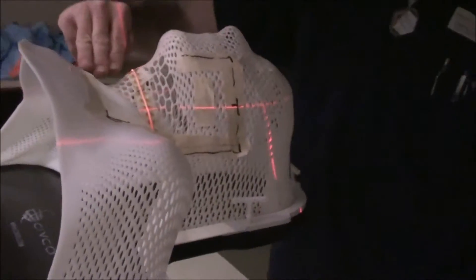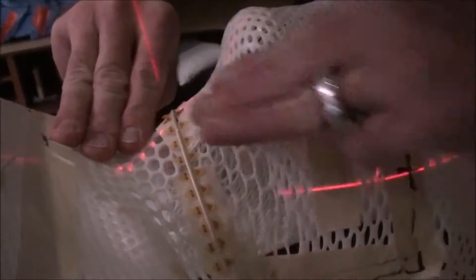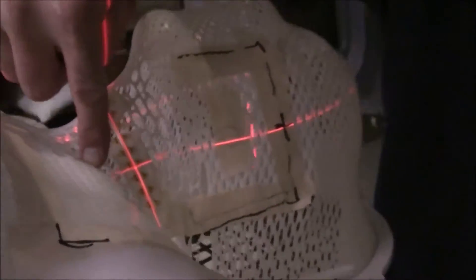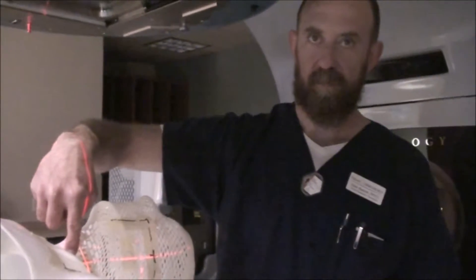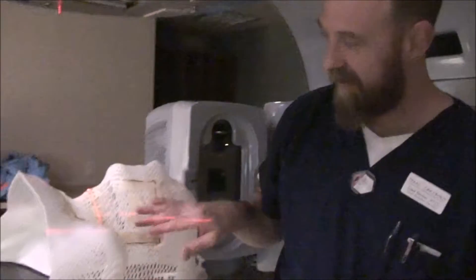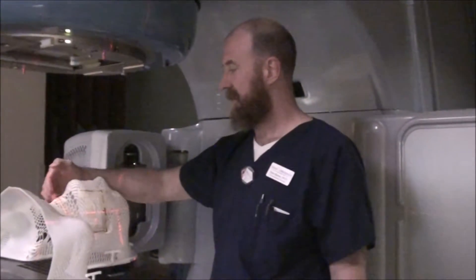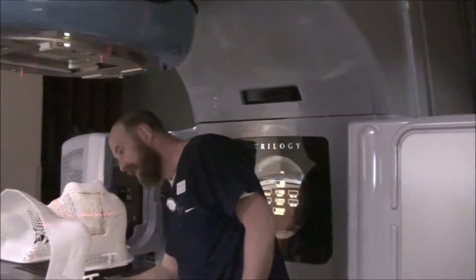Go three up and three over. Put your BB on there — that's going to be your dose point. Now that you've got your dose point on there, something I forgot from the last one: at the very end of your SIM, you need to go over and get an SSD and a separation there at that dose point.